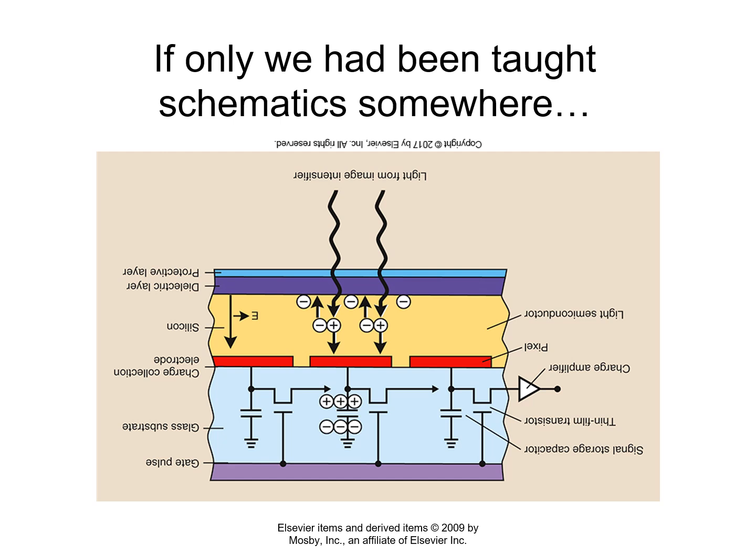Well, the third row of pixels shifts the charge to the second row of pixels. Why is the second row of pixels' capacitor empty? Because they have shifted their charge to the first row of pixels. Well, why is that one empty? Because they have already dumped their charges to the charge amplifier.